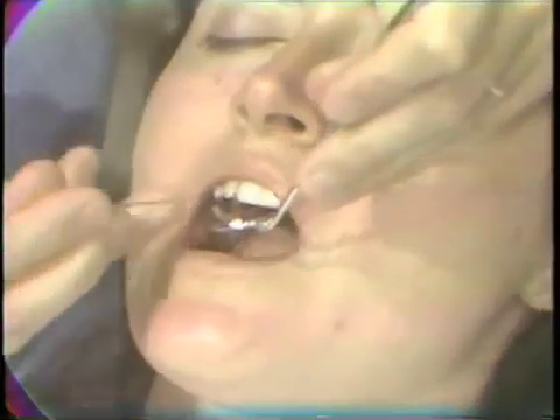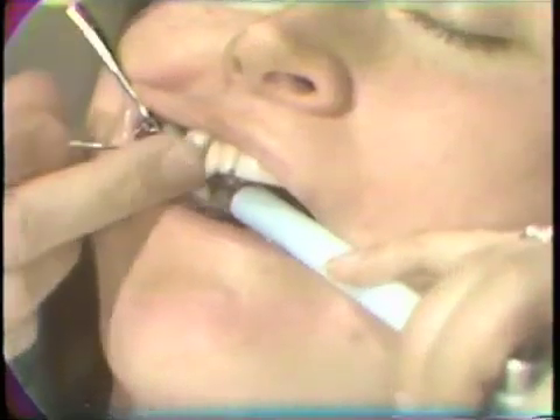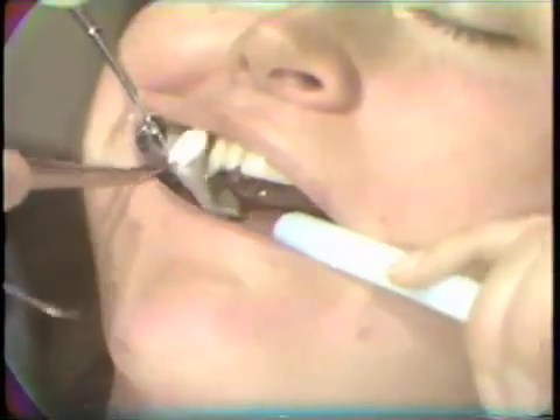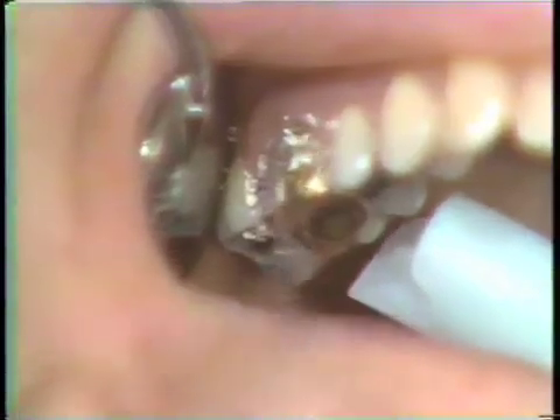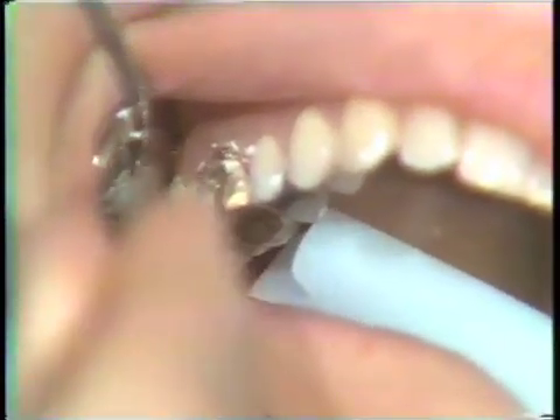After adequate setting time for the zinc phosphate cement, the cotton roll is removed. The excess cement, which is now hardened, is going to be removed. All the cement must be removed, and especially that which is in the interproximal areas. These embrasures tend to be filled with cement, so much care must be taken to be sure that all these areas have the cement completely removed.